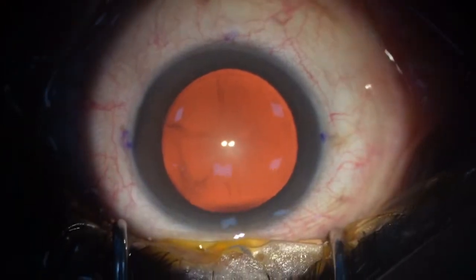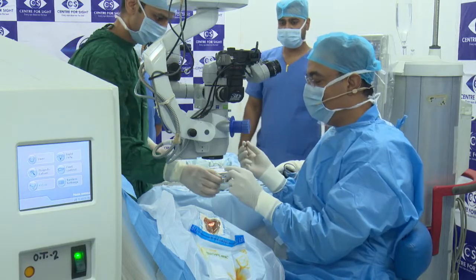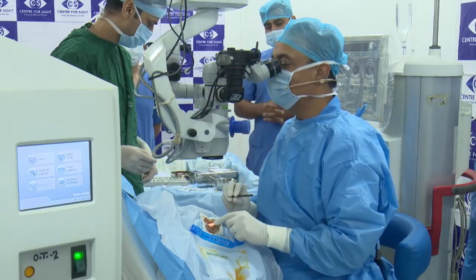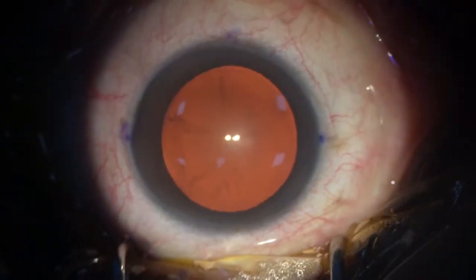Hi, Dr. Alkesh. So I'll be operating on the Signature Pro here, and I'm planning to use a toric lens. I'm planning to use an iHands toric. This patient has significant astigmatism.